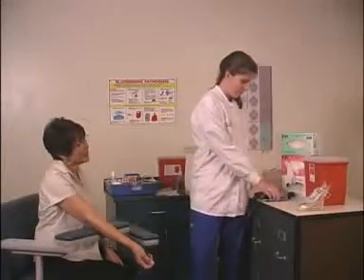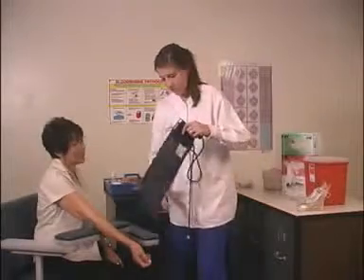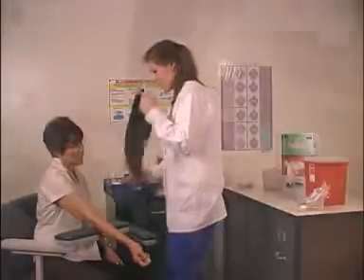Determine whether the patient has taken aspirin or any other salicylate-containing drug within the last 2 weeks. Advise the patient of the potential for scarring.